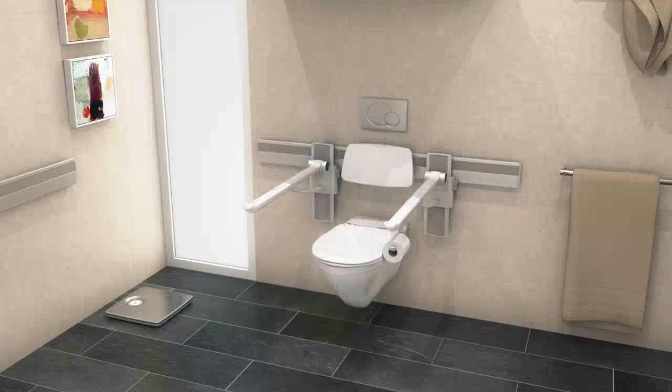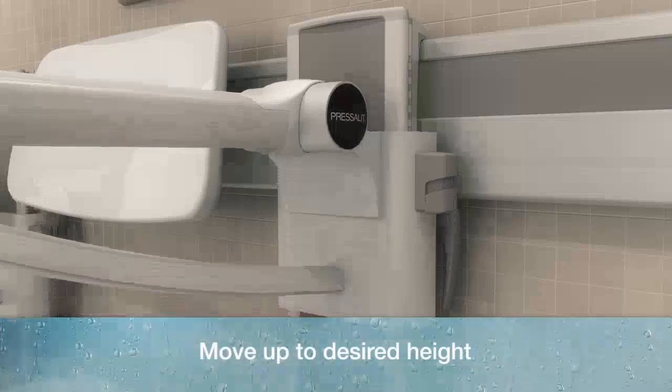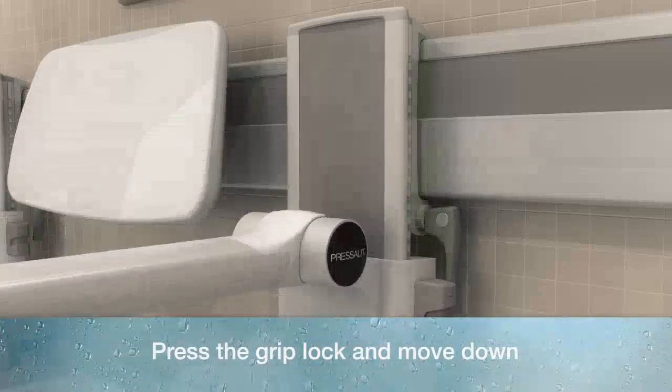Choosing Press-A-Lit Care Plus gives you great flexibility to change the settings in simple ways. Take hold of the support arm and move it upwards to the desired height, or press the grip lock to bring the support arm down to a lower position.